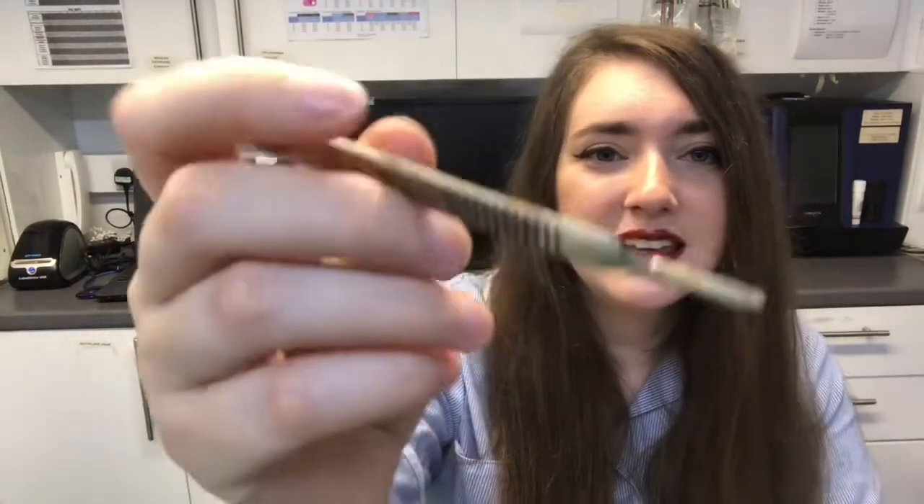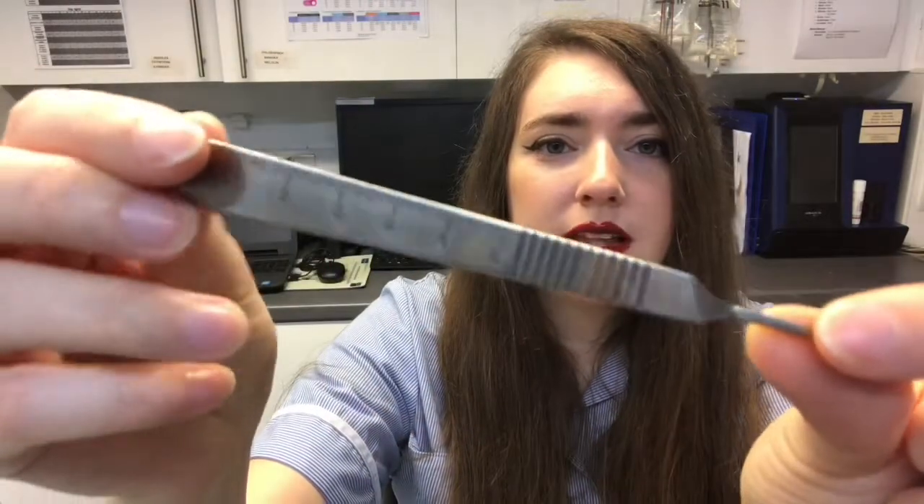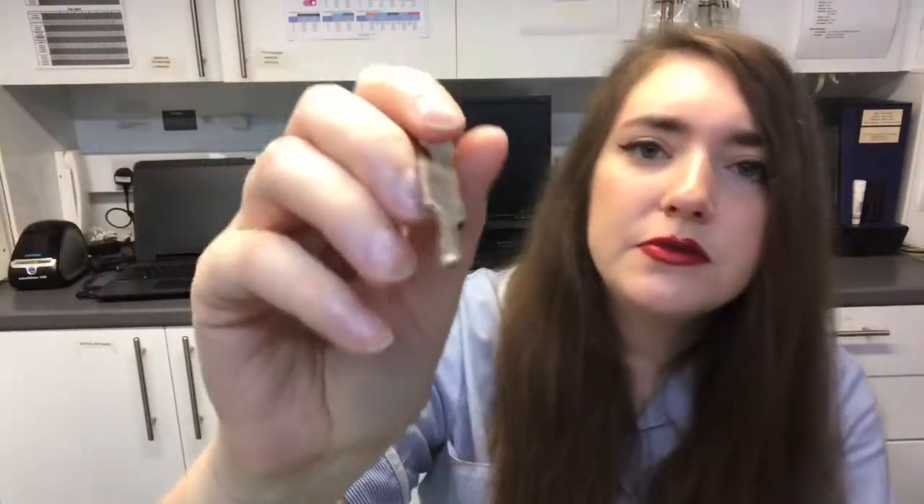Scalpel handle here. If you can look closer, there's a little slit there and that's where the scalpel blade will go. This is used to make the first incision of the patient.